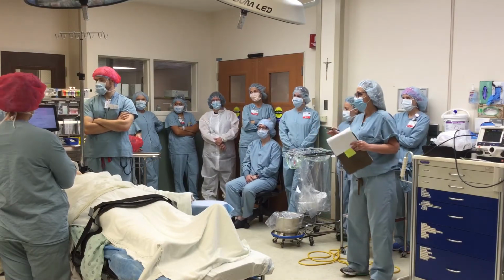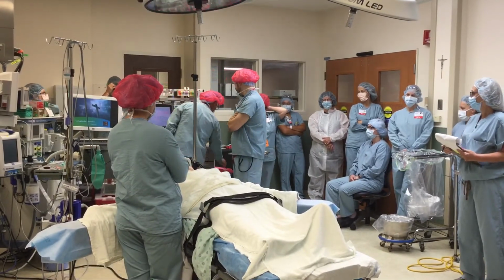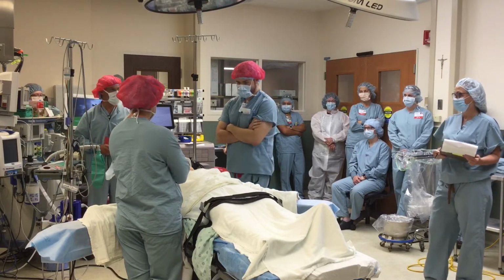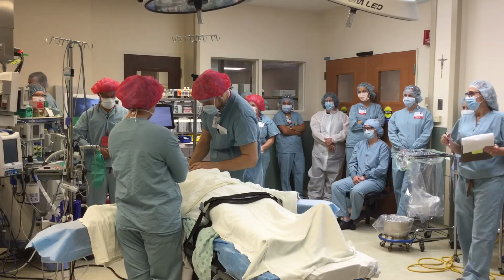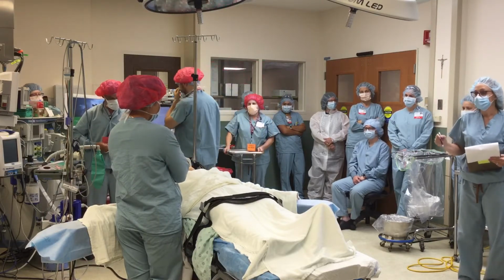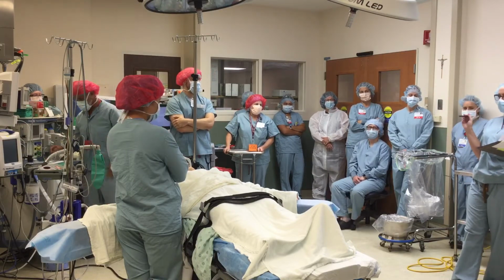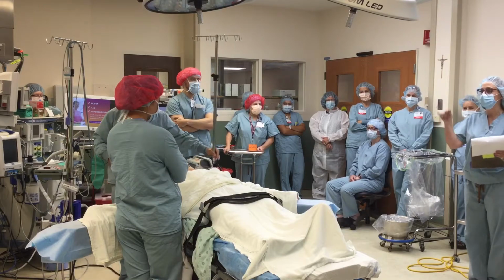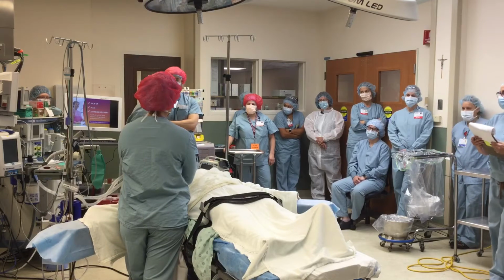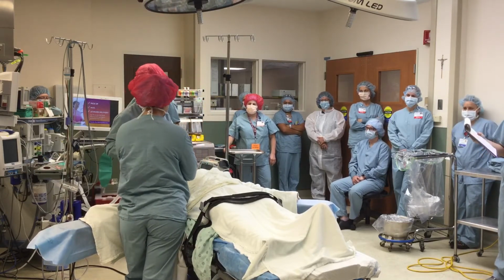Is this an intubatable mannequin? Yes. He is an intubatable mannequin. I feel like you're going to need some lubricant. So again, the most important part is don't ask questions. This is a patient, you wouldn't be asking a lot of questions like, do I do this, do I do that? You just do, and we'll talk about it afterwards. I don't think this is an intubatable mannequin. We'll just bag him then. It doesn't have a mouth opening other than the hole.